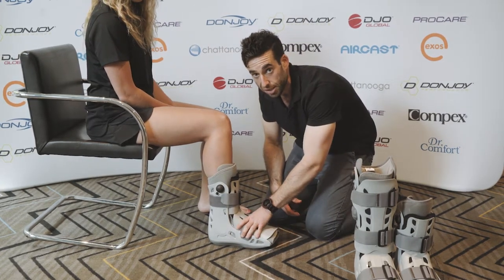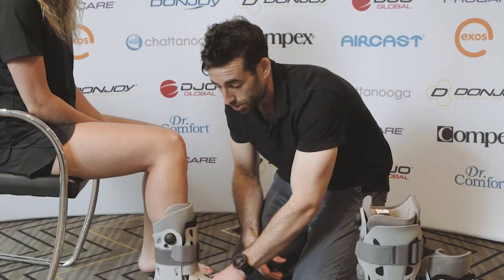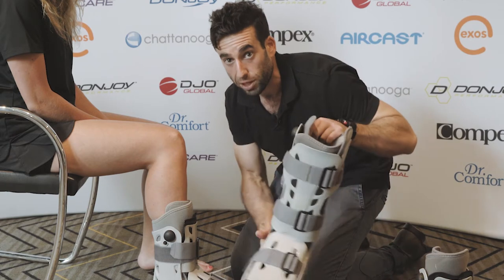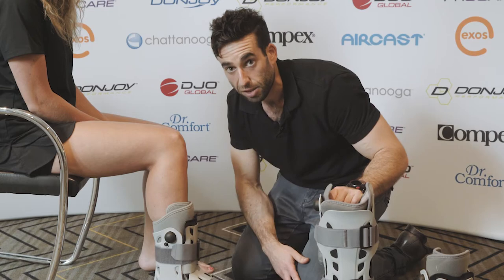You always want to ask them to have a snug fit, and then you'll get the patient walking to see how it feels. It's also important to note that if there's a higher ankle sprain you would need to use a long boot air cast — I would only be using a short boot for your standard lateral ligament sprain.